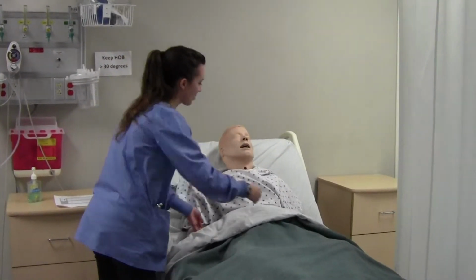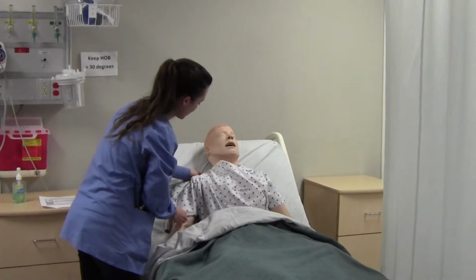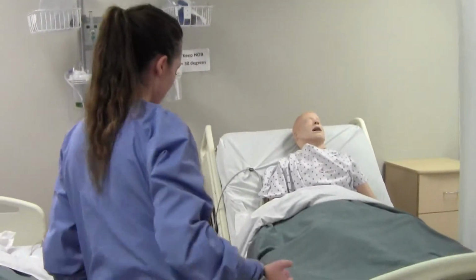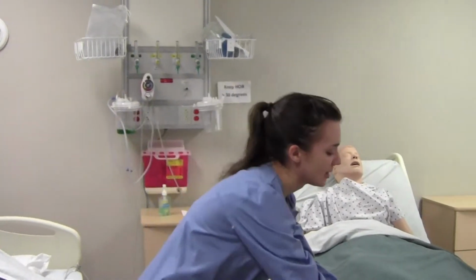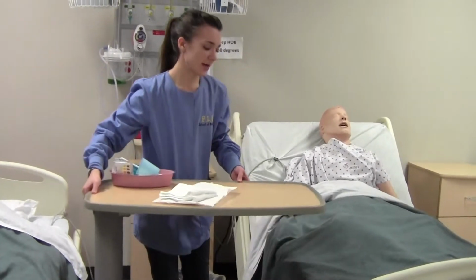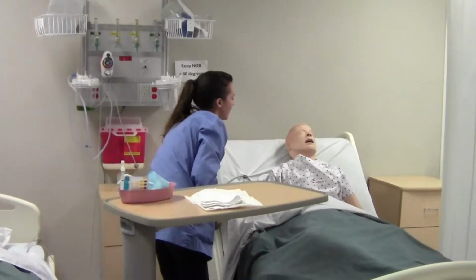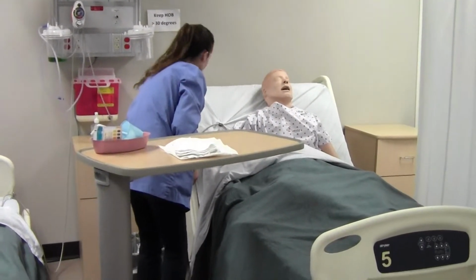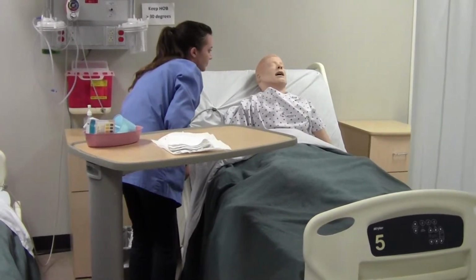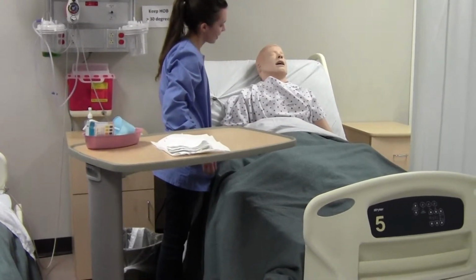We have your head back. I'm going to make sure you sit up in bed. Okay, perfect. There we go. Alright, so I'm going to pull my supplies around here. I'm going to take this trash can and pull it over by me. Take this, pull this up to my height. I'm also going to pull your bed up, and I'm going to position you in high Fowler's position. There we go. I'm going to pull you right on up, to a comfortable length where I'm working with you.